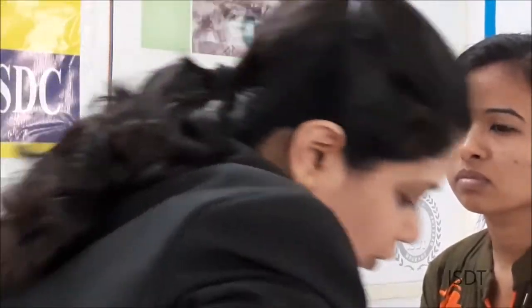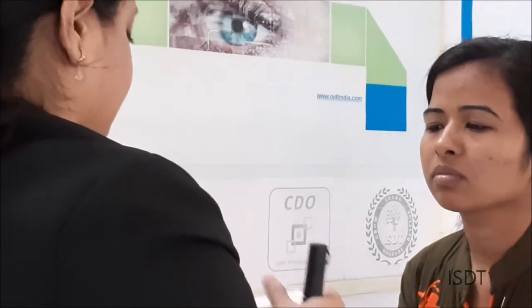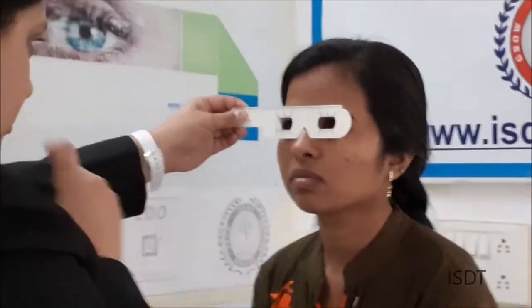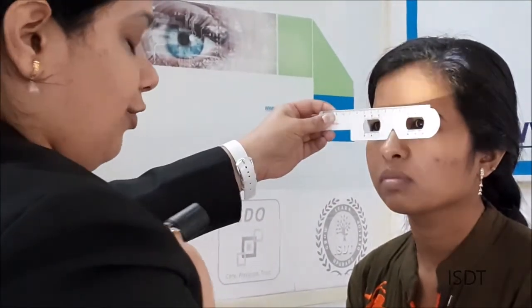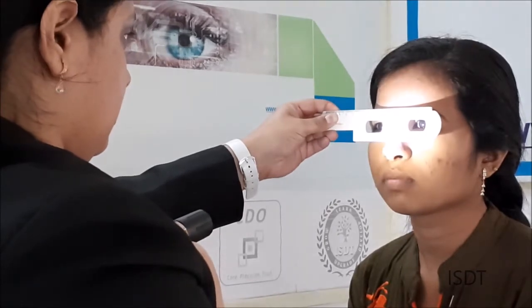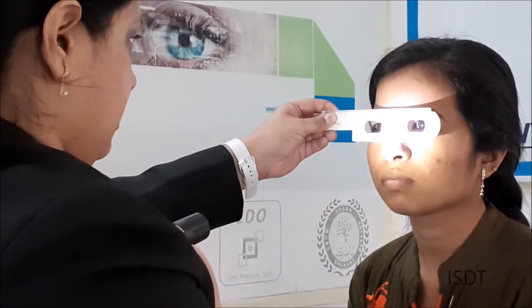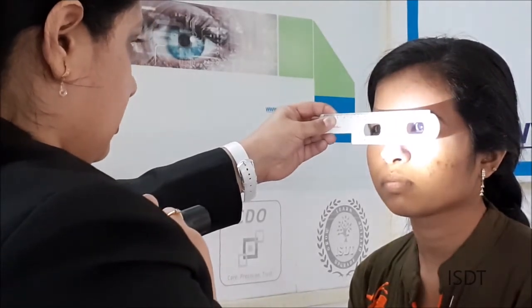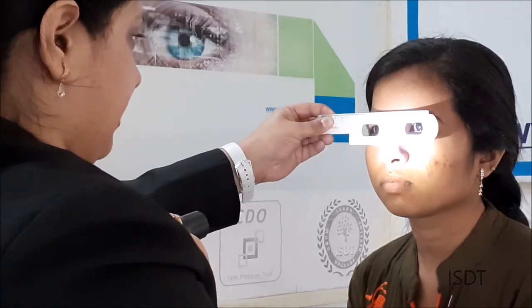Now I am going to do it for the near. So I am going to go to center. Ma'am, please look at my nose. When you are doing it for the nose, you have to shine the torch from below. This is 29. Please look at my nose. And here it is 26 millimeters.